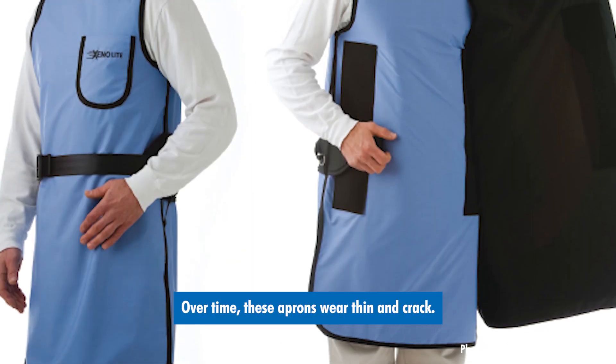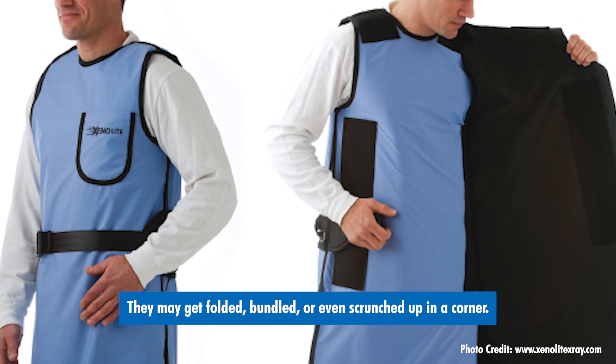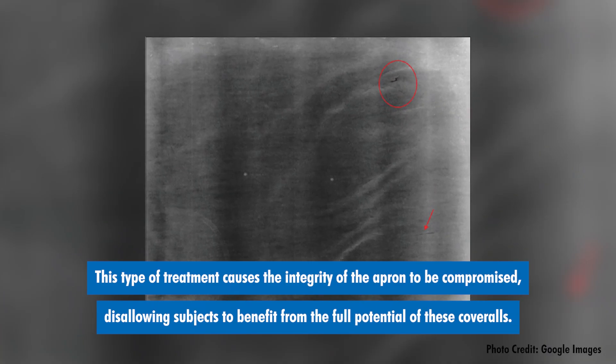Over time, these aprons wear thin and crack. They may get folded, bundled, or even scrunched up in a corner. They may be mishandled or abused. This type of treatment causes the integrity of the apron to be compromised, disallowing subjects to benefit from the full potential of these coveralls.